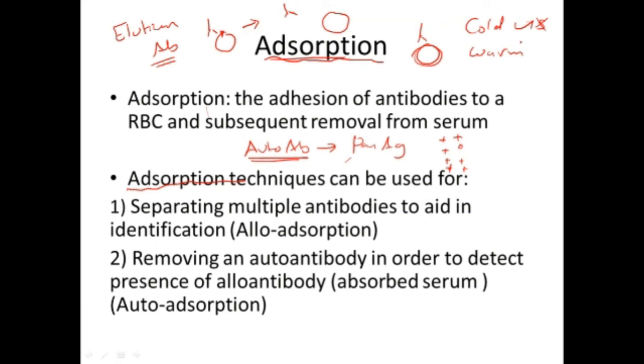طيب different way. بعض الأحيان مثلا زي ما تذكرون قلنا اختيارنا للطريقة تعتمد على إمكانياتي أنا في اللاب. وش عندي؟ هل أقدر أستخدم هذه ولا أقدر أستخدم هذه؟ ولا البوليسي عندي تقول استخدم أكثر من واحدة؟ على حسب. فمن ضمن التكنيكس الادسوربشن. أوكي، هذه ما تطرقنا لها سابقا، الحين بس نتطرق فيها.